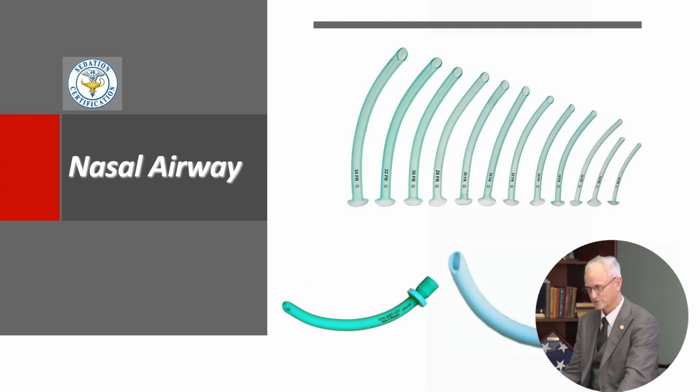Well, you can do this. Either you can put your finger up here and say blow, which I don't recommend. I've been caught with that one before. But have them do what you do. You're going to demonstrate. I want you to do what I do. Take your left hand and put it here like this and blow. Then take your right hand and put it here and blow.